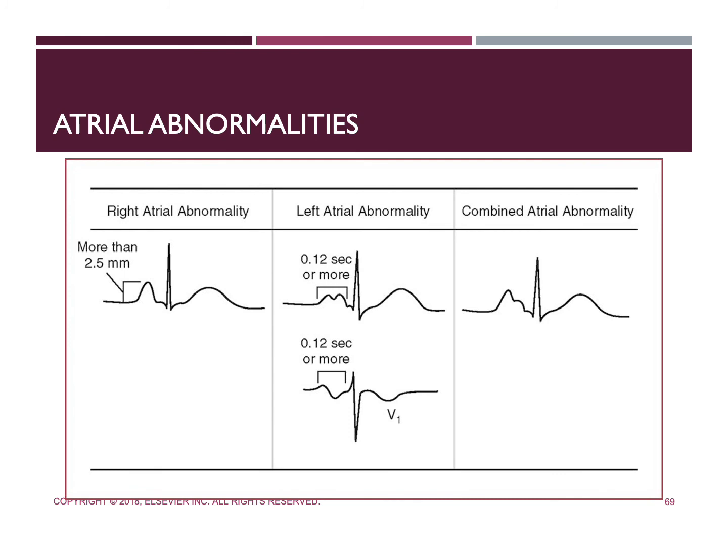When we move into left atrial abnormality, or LAA, the middle and end of the P wave is prolonged because that depolarization of the left atrium begins and ends later than the right atrial depolarization.